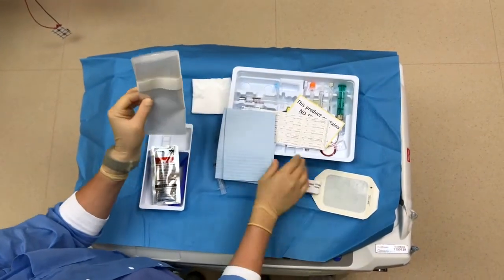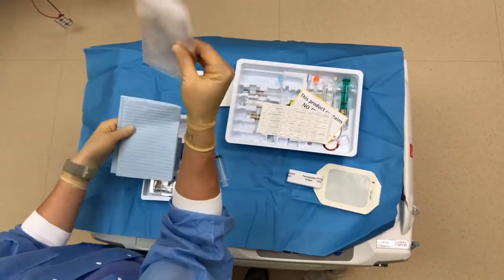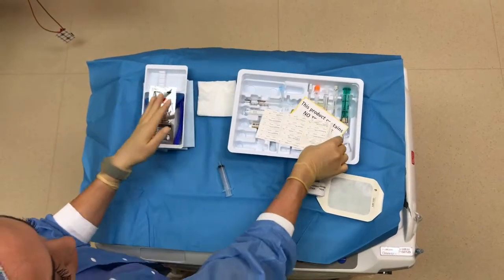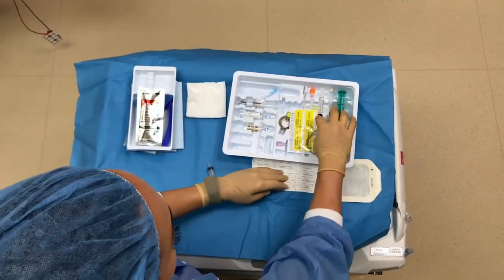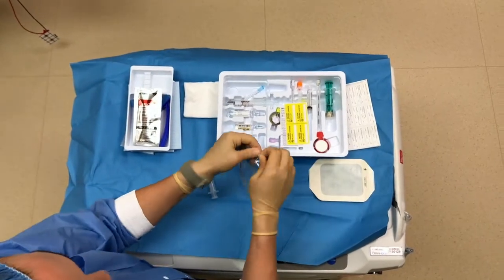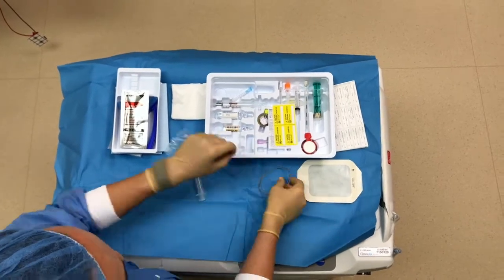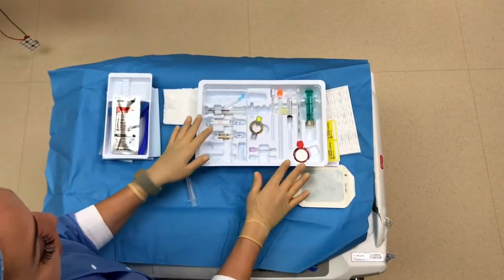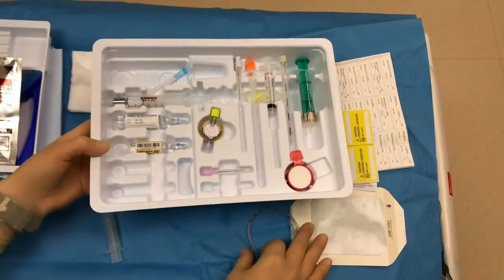Here's your plastic drape. I like to put them in this order because that's the order you usually blot off and then you put on your plastic drape. So I like to put these in the order that I'm going to use them. Here's some labels, just generic labels for you. Here's your catheter that we'll talk about. It's for the epidural. You can go ahead and open that and set aside. Here's just more labels.